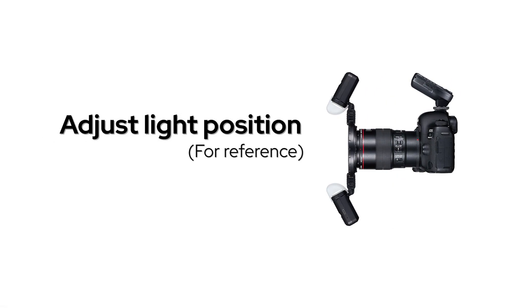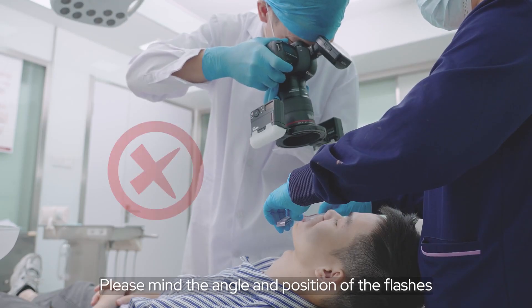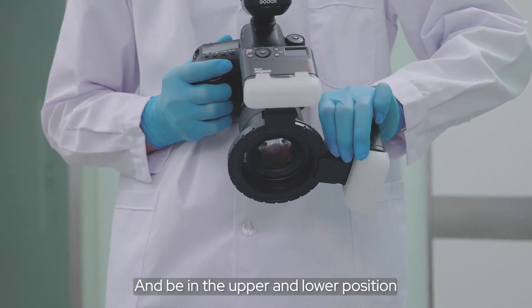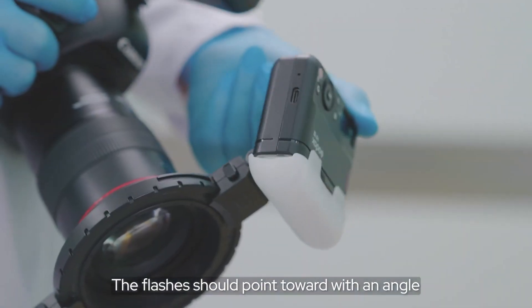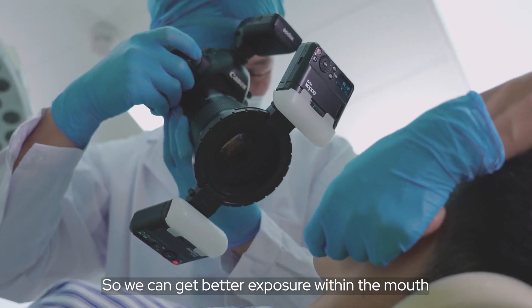Adjust the light position. Please mind the angle and position of the flash, keeping it in the upper and lower position. The flash should point inward at an angle so we can get better exposure within the mouth.